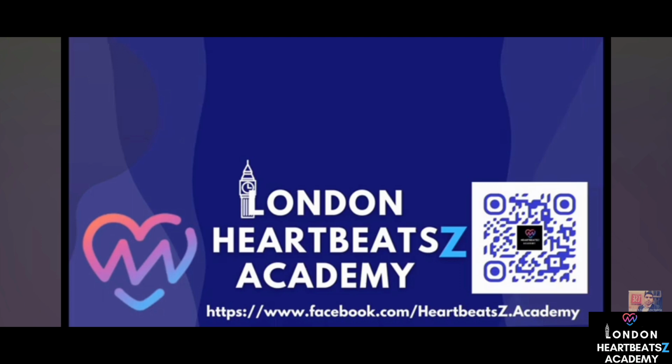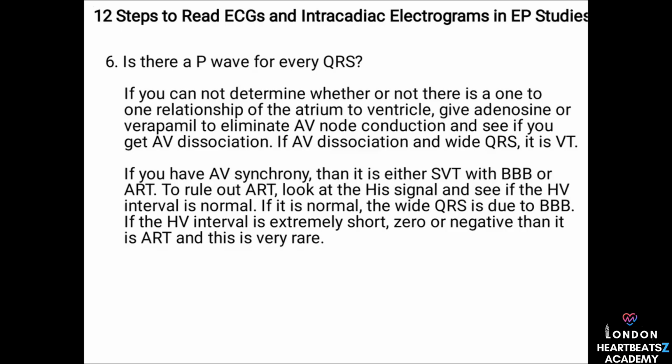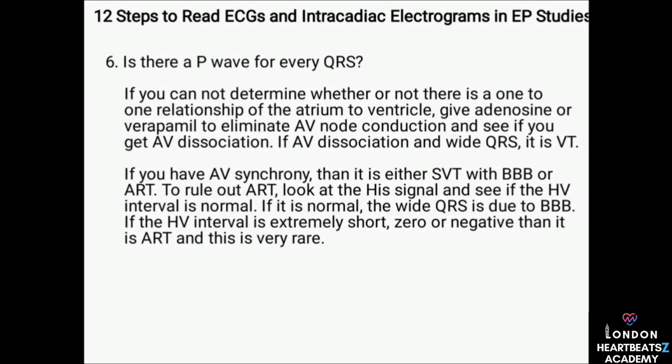All right, back to our ECG puzzle. Step 6, this one gets into the relationship between the P wave and the QRS complex, right? Right. We want to know, is there one P wave for every QRS complex? Are they in sync? Okay, so what if they're not? Well, if it's not a one-to-one relationship, it could mean we're looking at an SVT that's happening only in the atrium, like atrial flutter or atrial tachycardia. Could see multiple P waves for every QRS complex. It's like having two conductors trying to lead the orchestra at the same time.